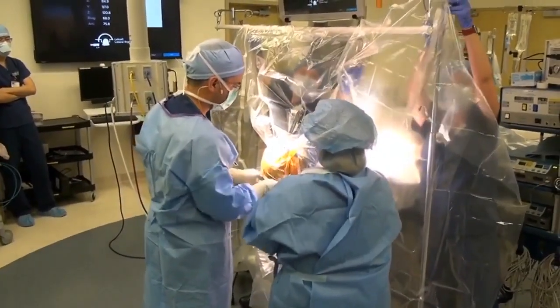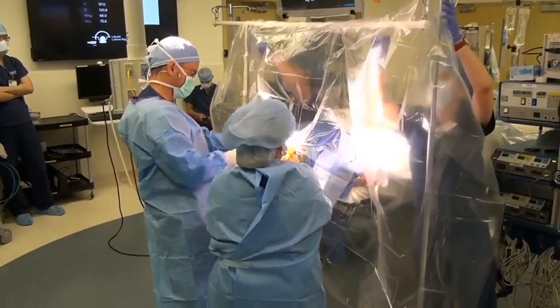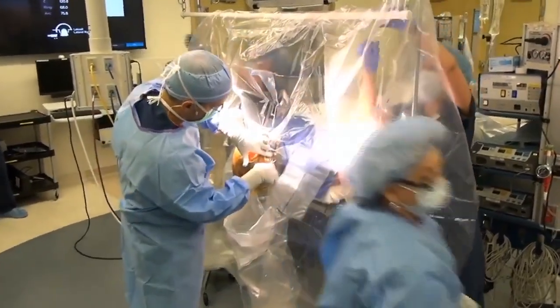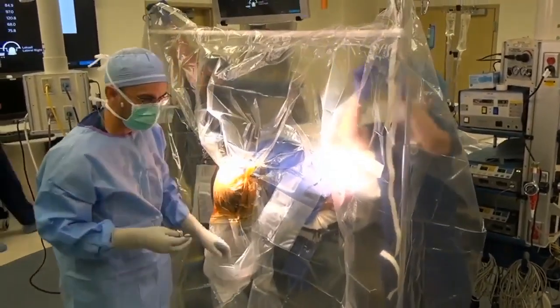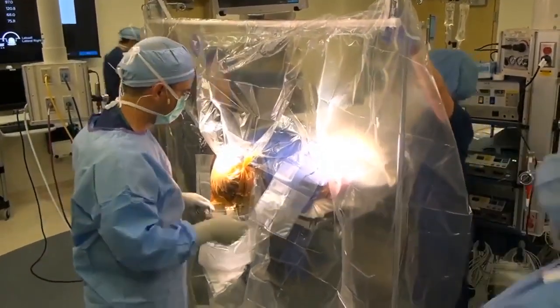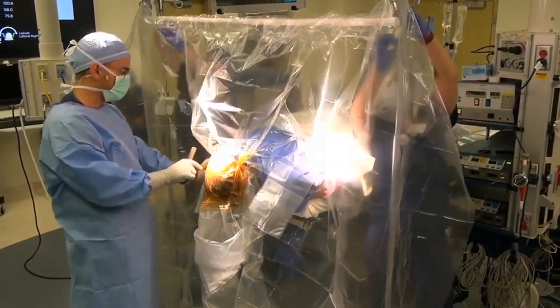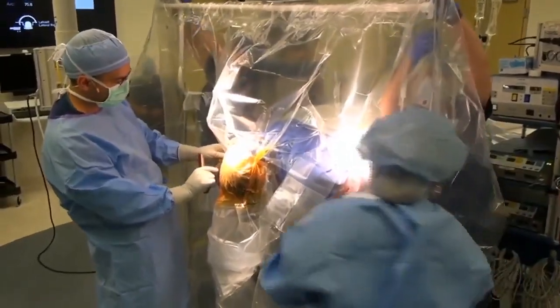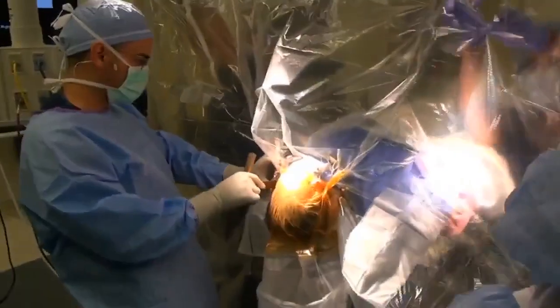Okay. All right, contaminated tip. So again, we kind of had a dry run already, putting together all of our coordinates, and that dry run was just for the haircut.